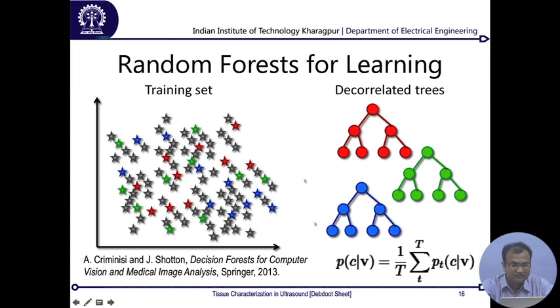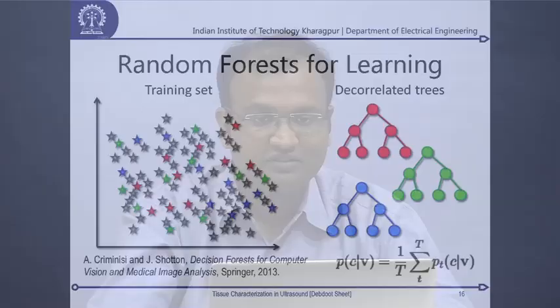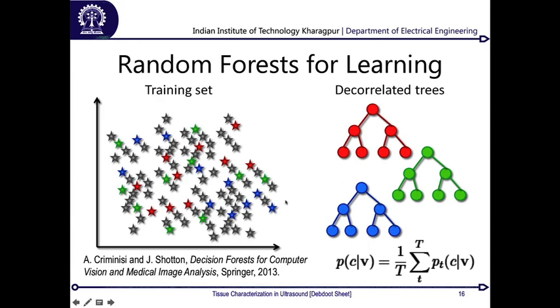One good thing is that we use a random forest for learning, which makes our whole process independent of the topological behavior of samples, as we have studied in the random forest lectures. You do not need to know the prior probability of the samples, or the topology of the feature space on which you will have your discriminator. Whether you have a linear or quadratic discriminator, it is independent of that, and that beauty of random forest helps us learn this whole feature space in a much stronger way.